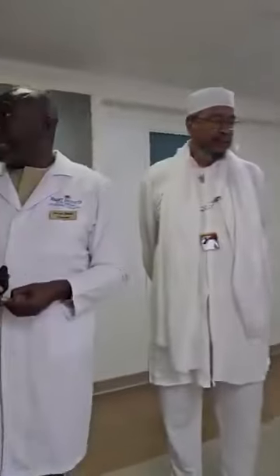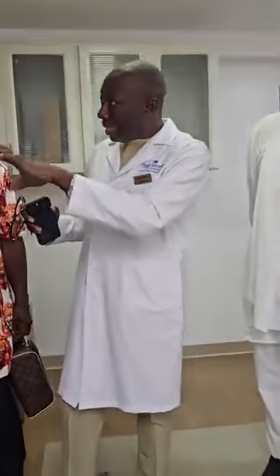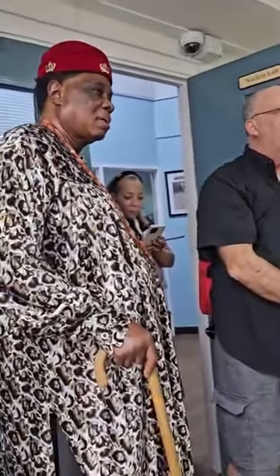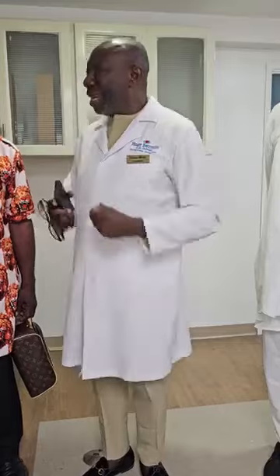So this is a form of irradiation? Well, targeted irradiation? So what it is, you get radioactive material that is safely introduced into the system, right? And then we use this to, it doesn't irradiate. It's not X-ray, it images it to check the count density. And so the count density, to give you an example, right? It's like a radioactive reading. If we want to see whether you have blockage in your blood vessel, we put you on a treadmill, and then you walk. Theoretically, the blood vessels should open up and flow will go.